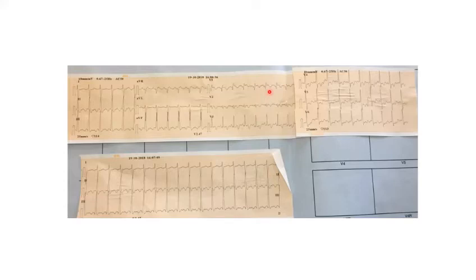Is it Epstein, sir? No. No. Right axis deviation with RSR dash pattern and all. Do you think that this could be atrial septal defect? ASD, sir. Atrial septal defect patients can have atrial arrhythmias. And so this is a 2:1 block. You should carefully look for it, because you can see this is a P wave, rather a flutter wave. And this is a 2:1 flutter wave, 2:1 atrial flutter.